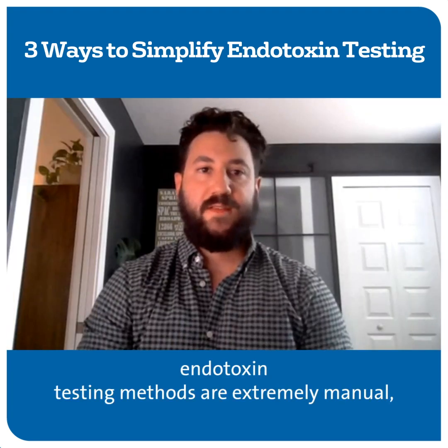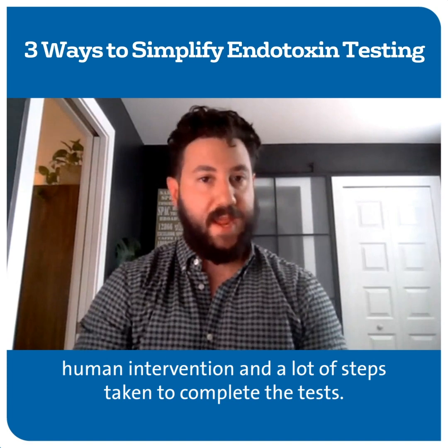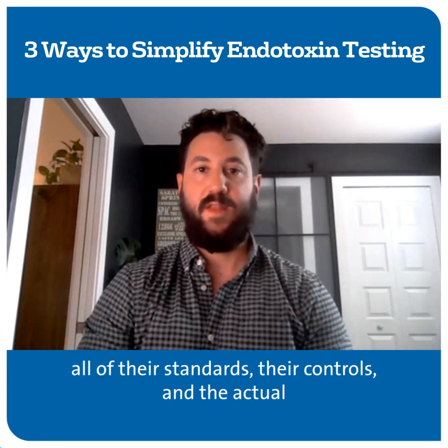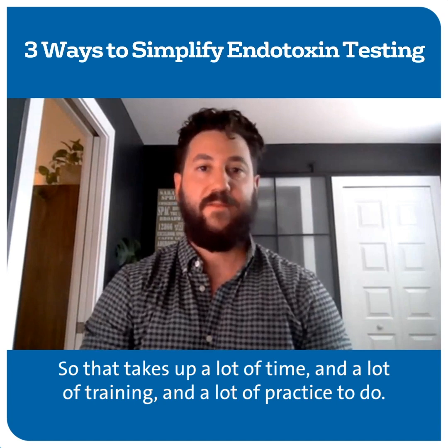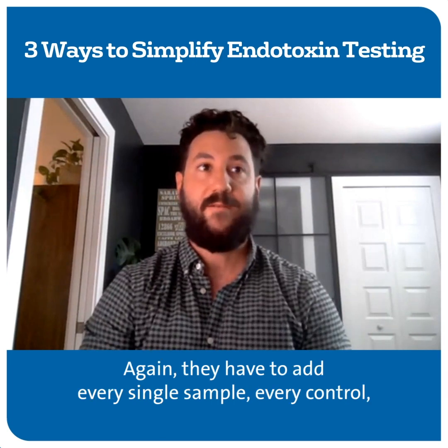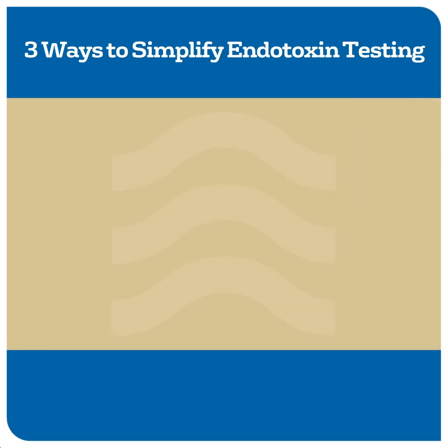The traditional endotoxin testing methods are extremely manual. That means there is a lot of human intervention and a lot of steps taken to complete the test. So the analysts will have to add all of their standards, their controls, and the actual LAL reagent. That takes up a lot of time and a lot of training and a lot of practice to do. The traditional methods are time consuming. They are prone to error. Again, they have to add every single sample, every control, every standard, and all lysate to the sample and then run.